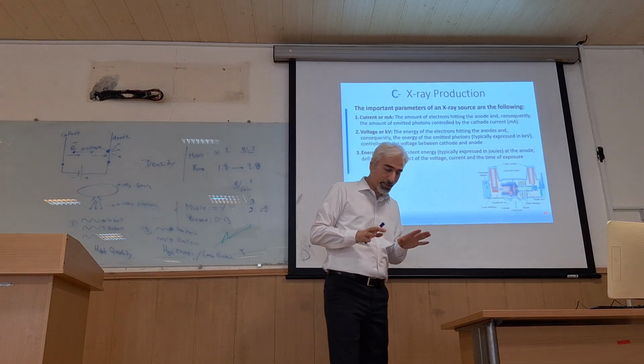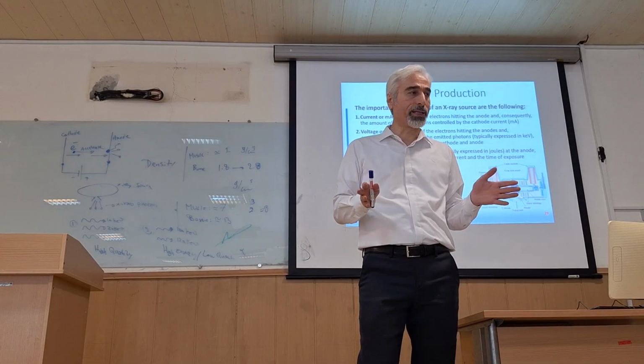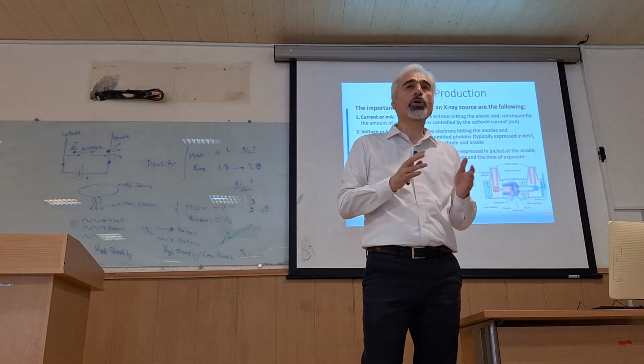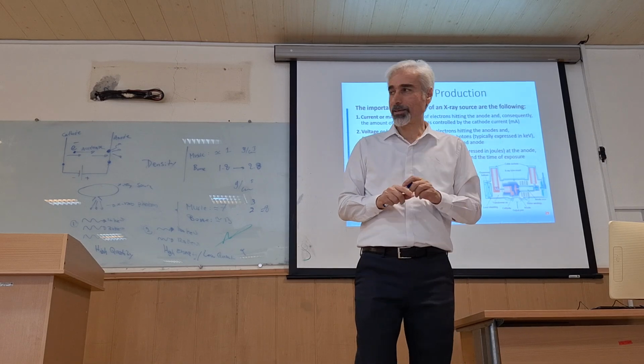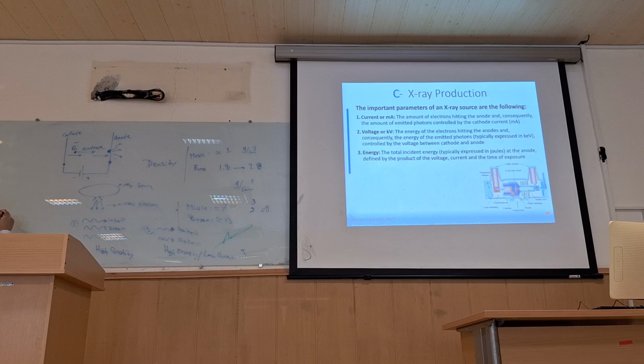When you look at the panel of a radiography machine or the panel of a mammography machine, you can see that the operator of the machine should adjust the MA, which leads to photon numbers, and kV, which sets photon energy.